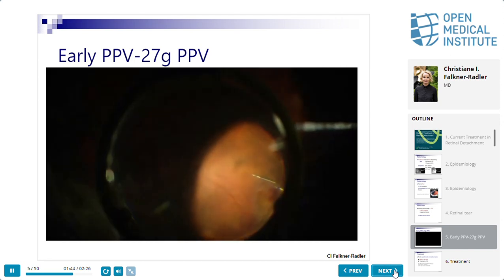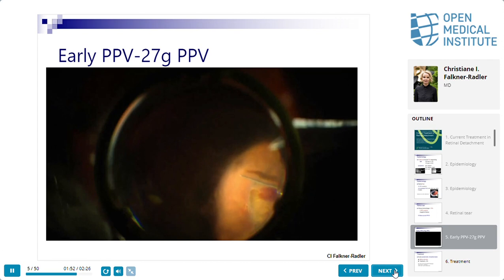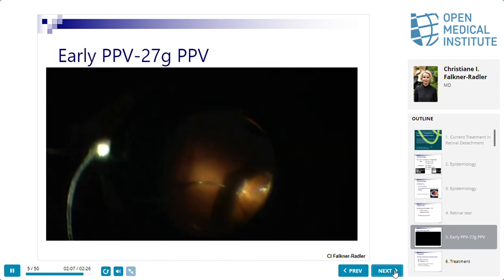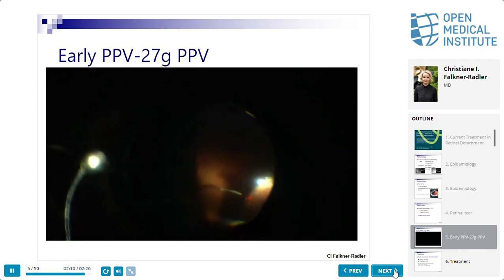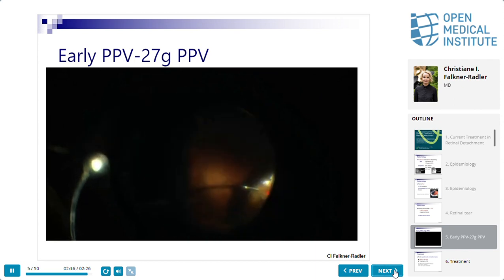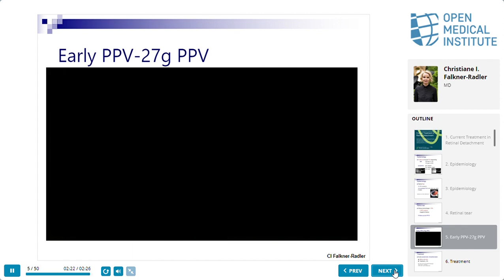You can also use the fluid needle, and here you see there's the indentation from the outside. This is the old tear, and there was some attachment from the vitreous, and this caused the bleeding. And now I'm cleaning the periphery with indentation from the outside, and I do again a laser treatment. And the rest of the hole was without any subretinal fluid, so I didn't do any air bubble filling or something like this. I just kept it without any tamponade.